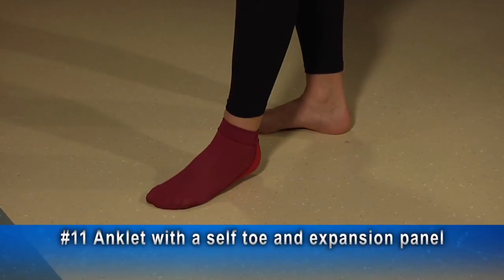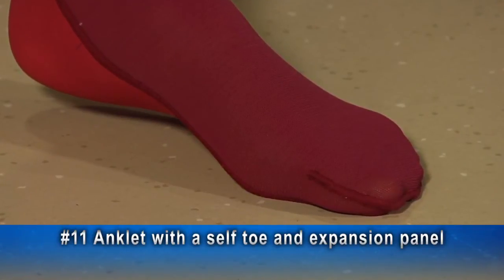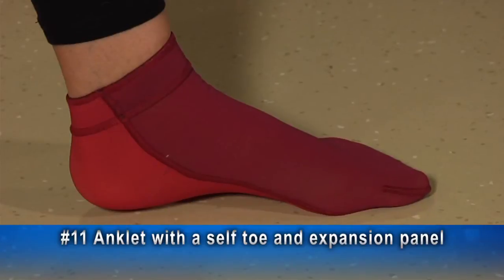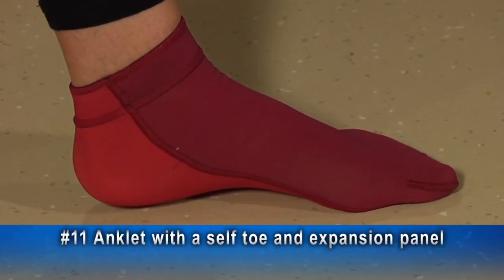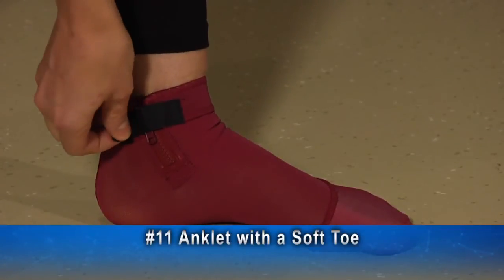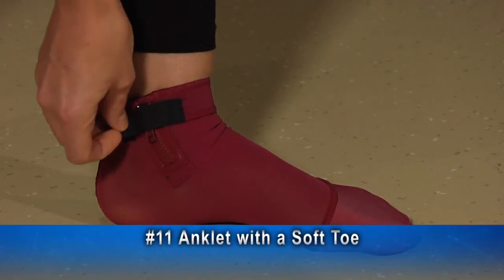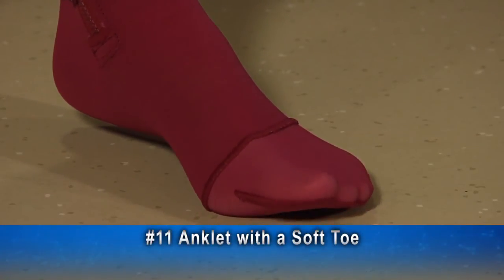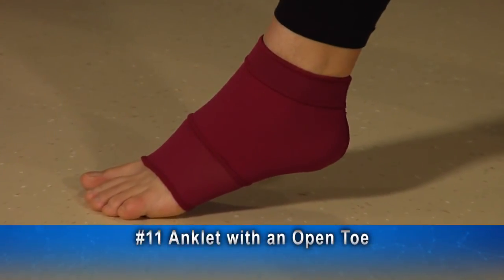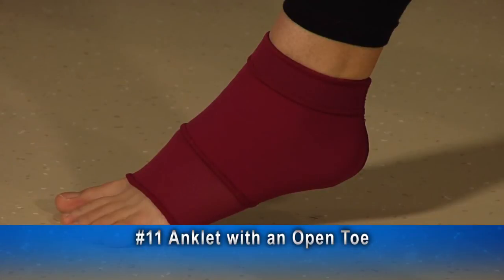Number 11 anklet with a self-toe and expansion panel: in this self-toe option, the toe box is made from the same fabric as the rest of the foot. By default on lower extremity garments, the expansion panel is posterior on the leg to the plantar foot. This is a number 11 anklet with a soft toe, medial zipper, and a velcro tab to keep the zipper from opening. In the soft toe option, the toe box is made of a soft lining material, with a seam around the foot joining it to the rest of the garment. The number 11 anklet shown here is an anklet with an open toe and a full ankle lining. In the open toe measurement, the stocking ends at your last circumference measurement.